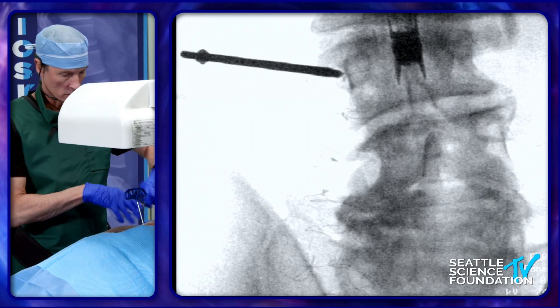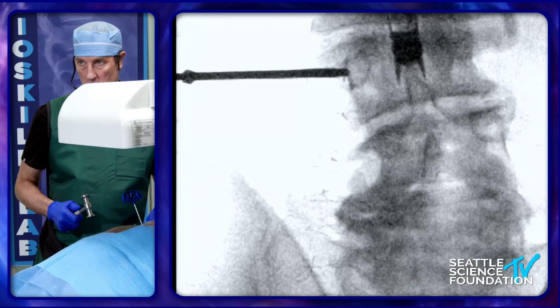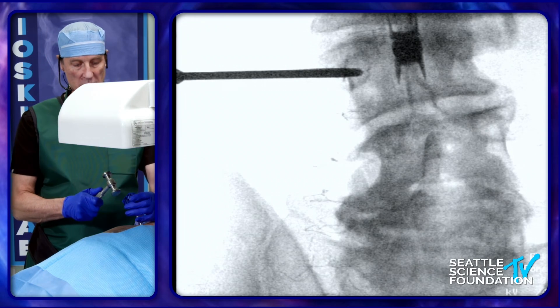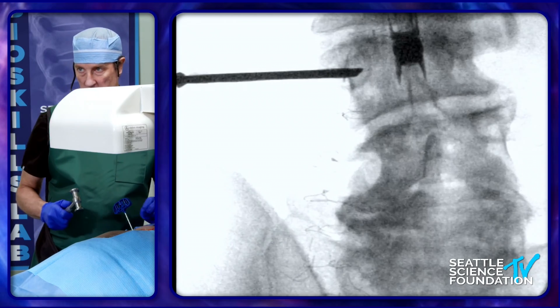So a good start point right there. I'm using a single beveled needle and we will come down using a similar approach as what Dr. Lee had, and we won't violate the medial wall of the pedicle until we're in the posterior portion of the vertebral body.